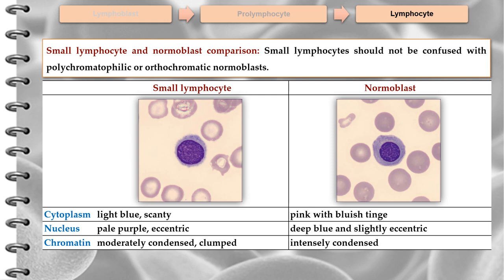Small lymphocytes should not be confused with polychromatophilic or orthochromatic normoblasts. Small lymphocytes usually have scanty pale blue cytoplasm, with a pale purple and eccentric nucleus showing moderately condensed or clumped chromatin. In comparison, polychromatophilic or orthochromic normoblasts have a pink cytoplasm with a bluish tinge. The nucleus is deep blue and slightly eccentric with intensely condensed chromatin.